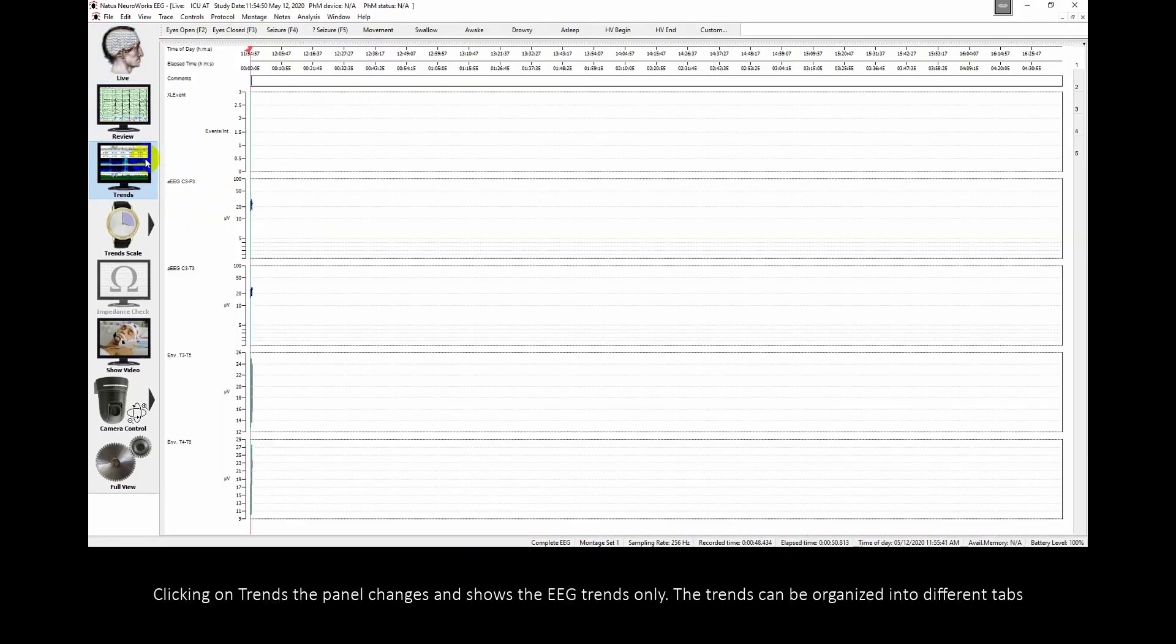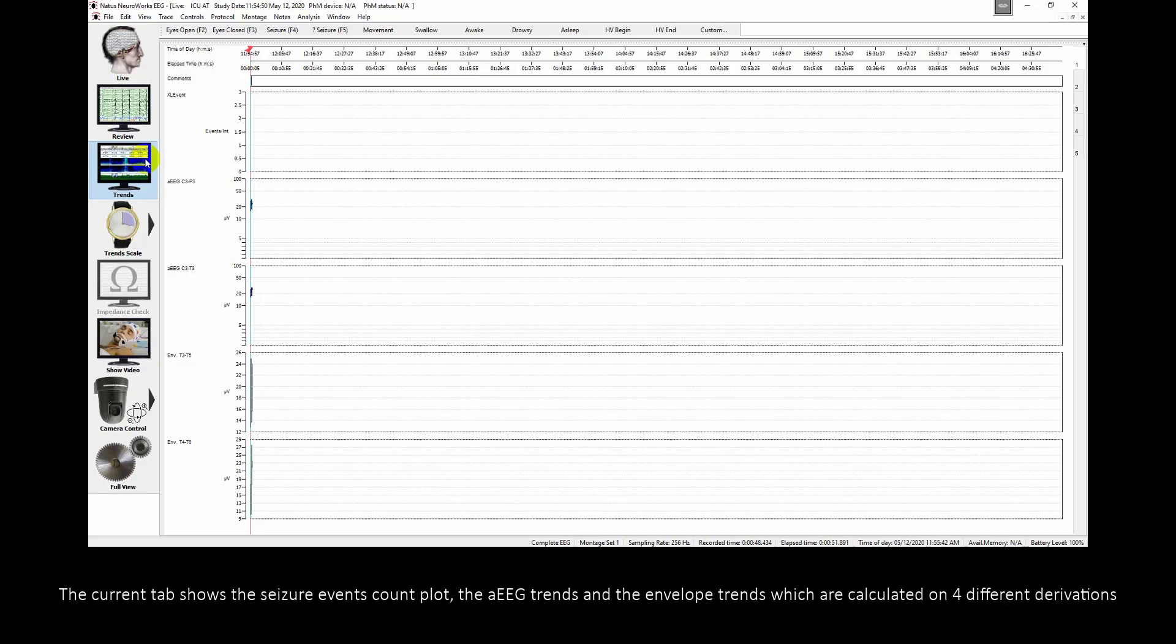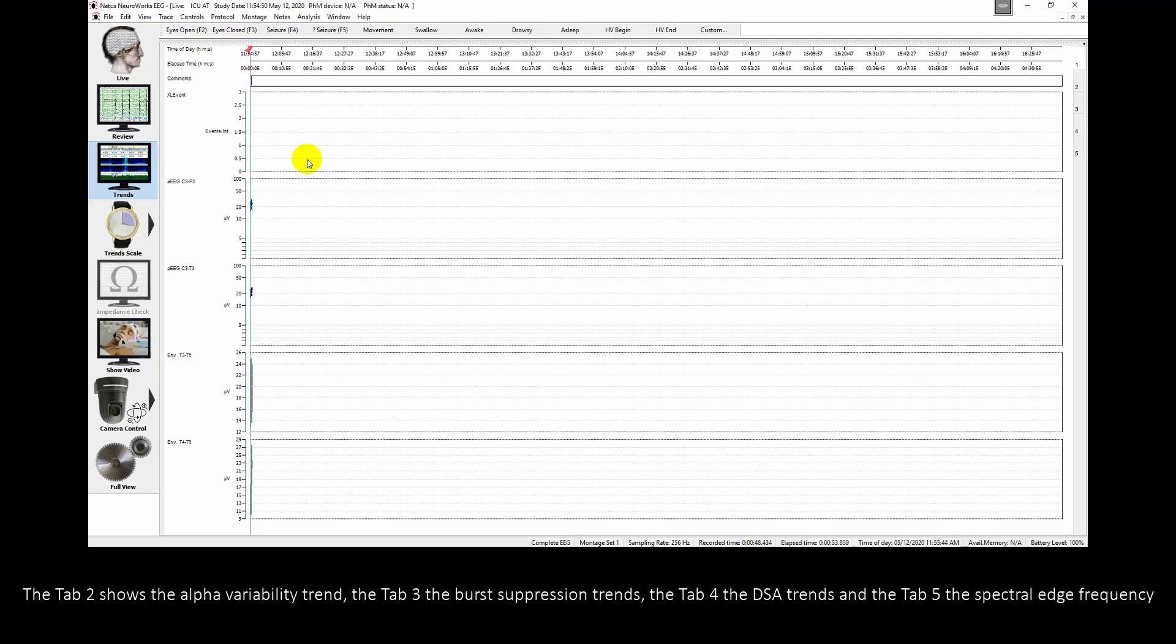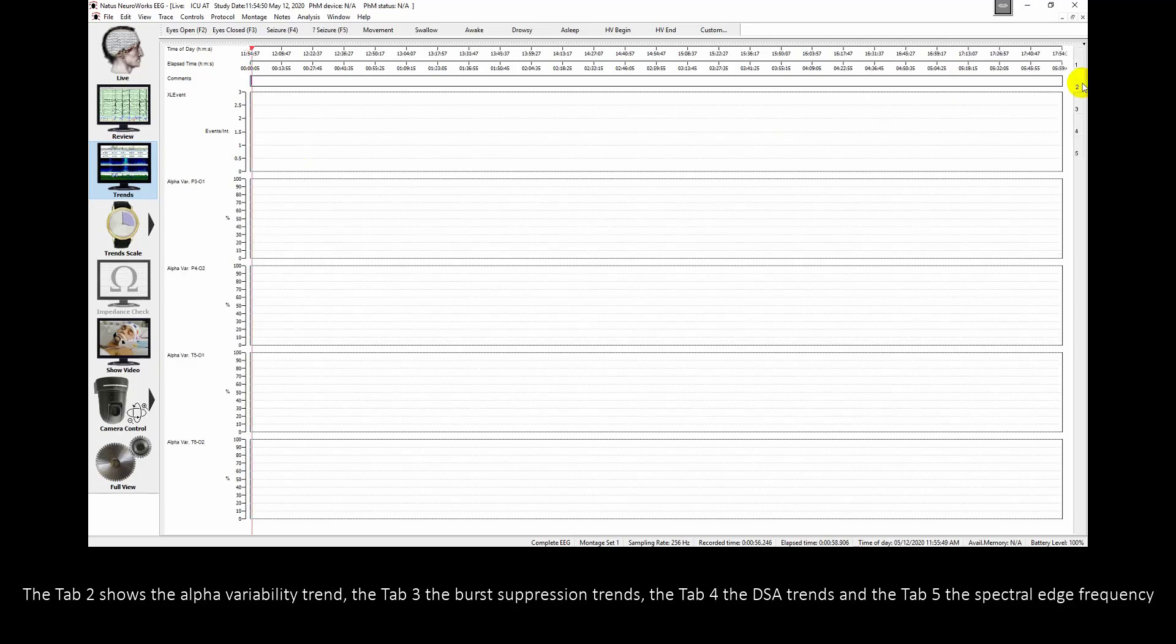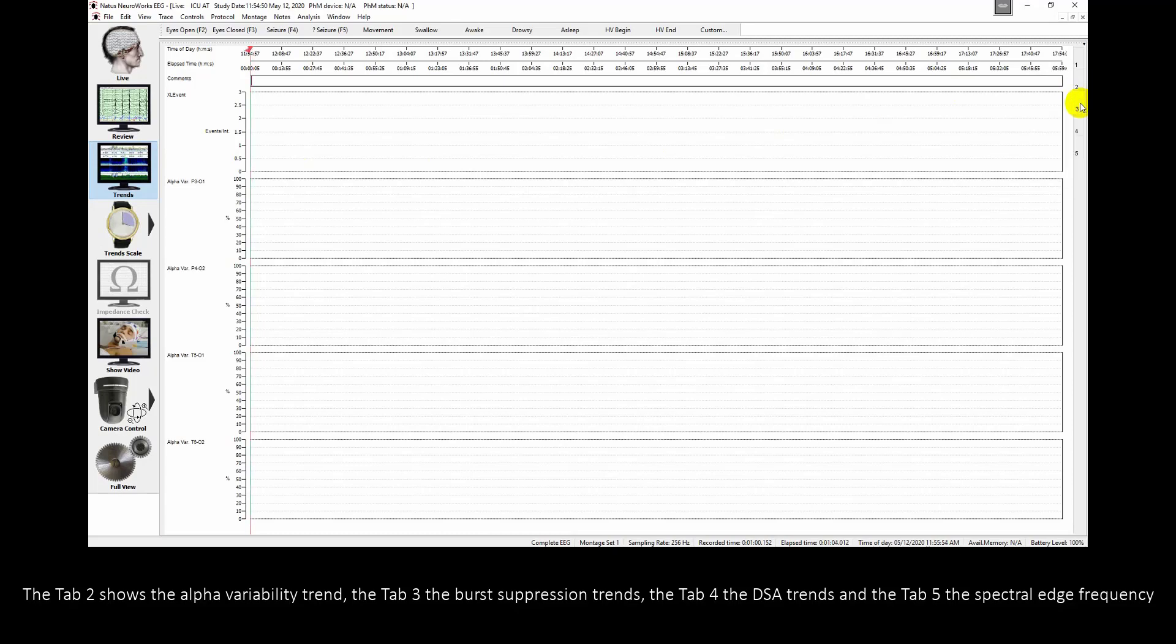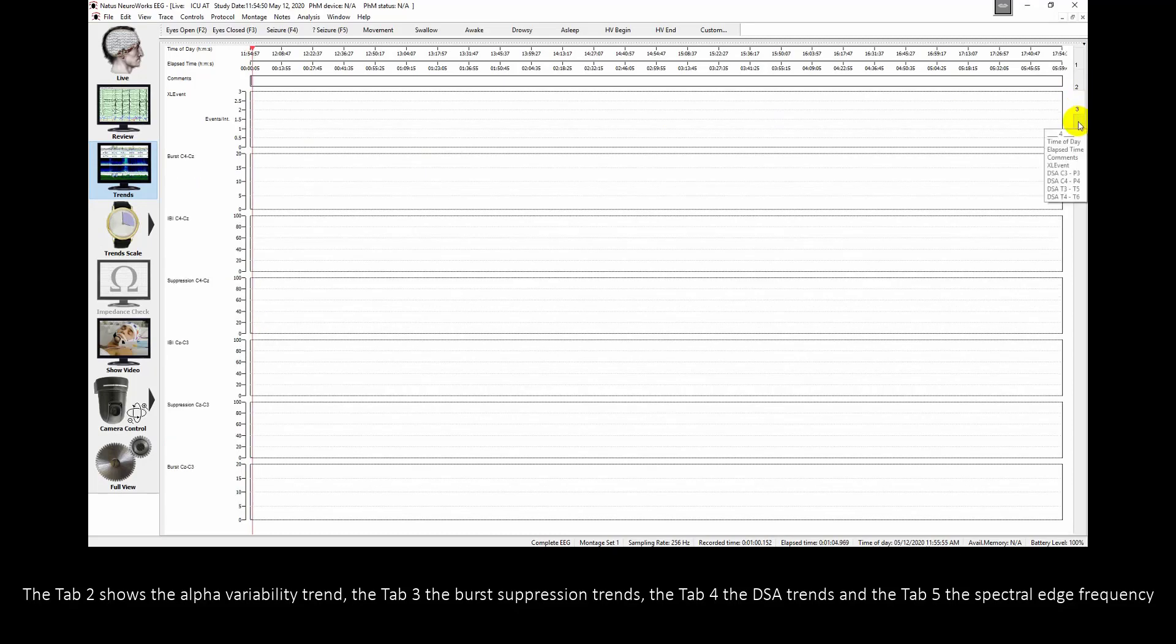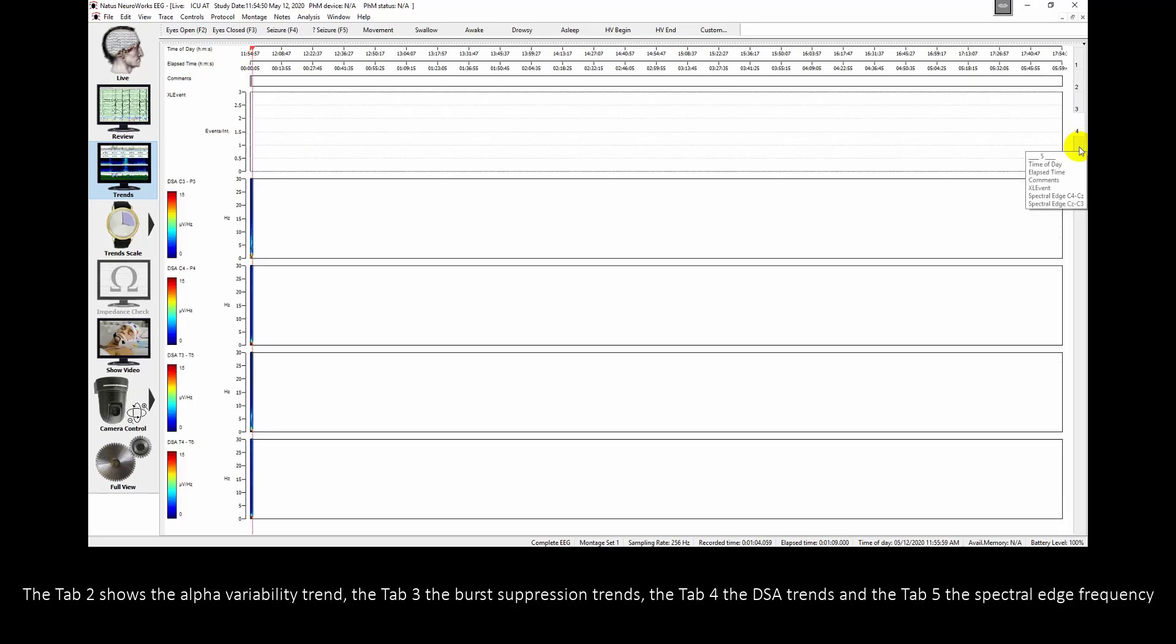Clicking on Trends, the panel changes and shows the EEG trends only. The Trends can be organized into different tabs. The current tab shows the Seizure Events Count Plot, the Amplitude EEG Trends and the Envelope Trends, which are calculated on four different levels. Tab 2 shows the Alpha Variability Trends, Tab 3 the Burst Suppression Trends, Tab 4 the DSA Trends and Tab 5 the Spectral Edge Frequency Trends.